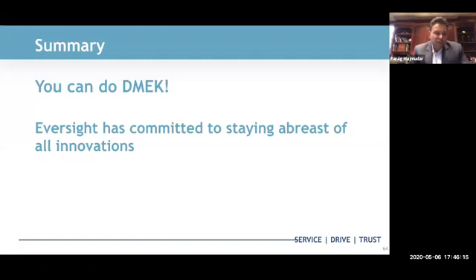And I'm not sure there's really a need to do that, because this tissue being only about 20 to 30 microns isn't really contributing significantly to any type of posterior corneal curvature changes. So to my knowledge, it doesn't matter in terms of rotational orientation compared to how the tissue is harvested. Again, I hope that's a clear answer to your question. If not, please clarify.